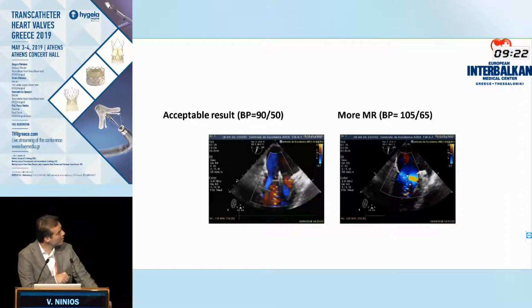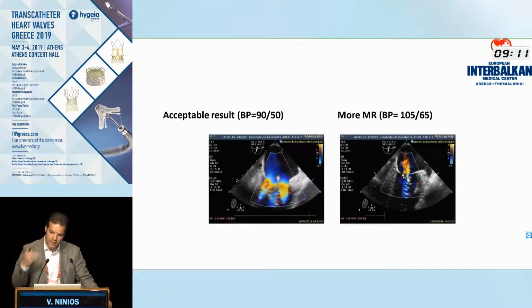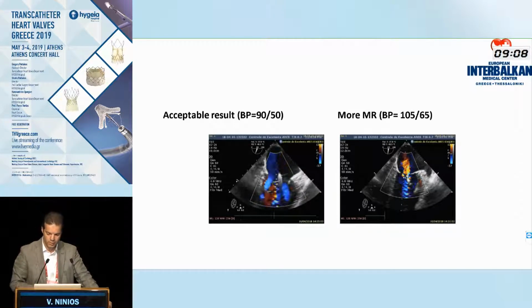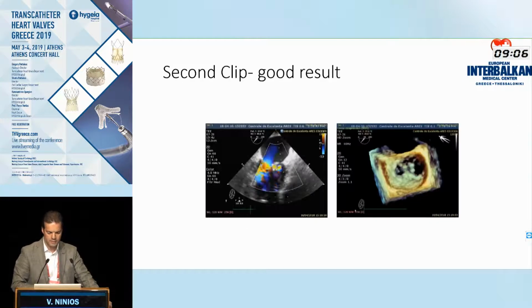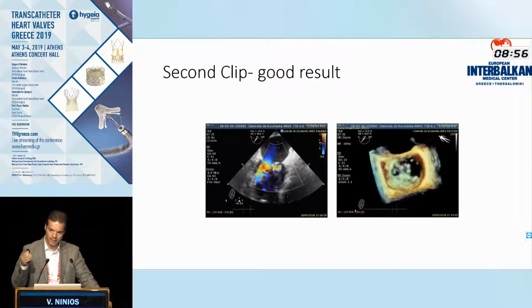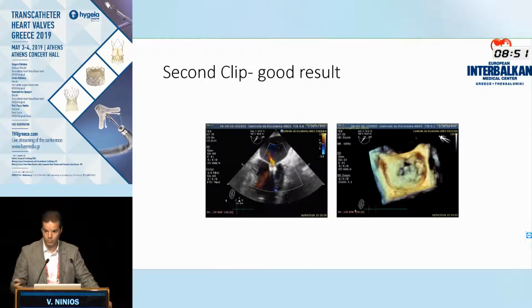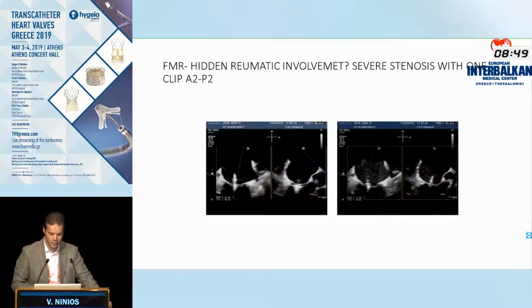But look at the blood pressure. Blood pressure is 90/50. So we increase the blood pressure to 105. You can see that there's a further jet arising from the medial aspect of the valve, which shows that you have to sometimes challenge the afterload of these patients. So you have to put a second clip on this one. So we put a second clip, and that's it. With a blood pressure of 120, 130, mitral regurgitation is gone. So we can predict the outcome based on the hemodynamic loading of this patient. And sometimes we have to challenge that on the table to make a decision.